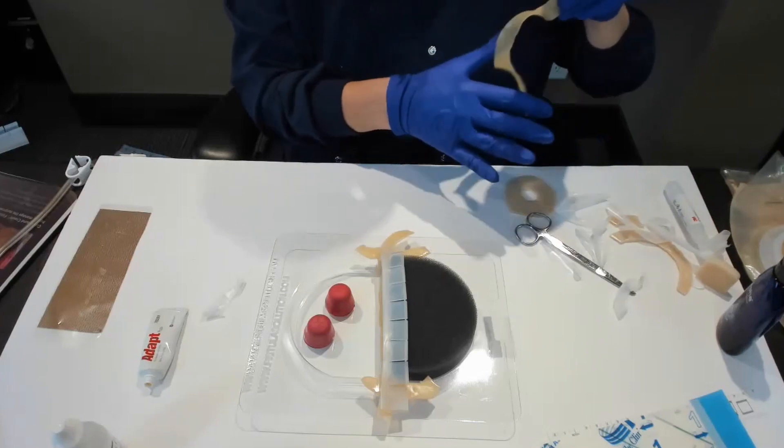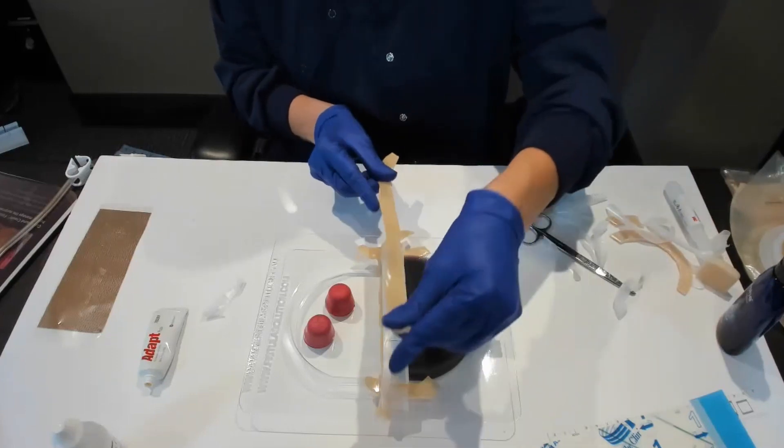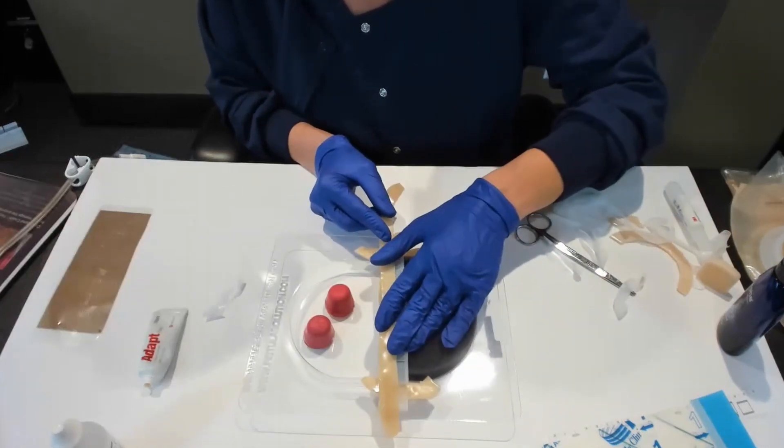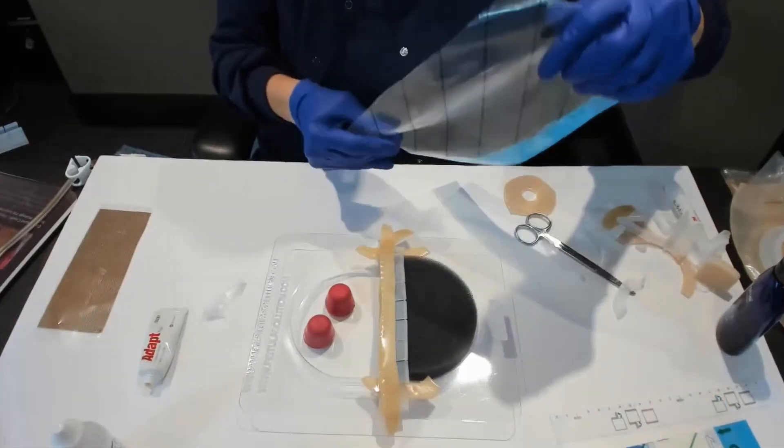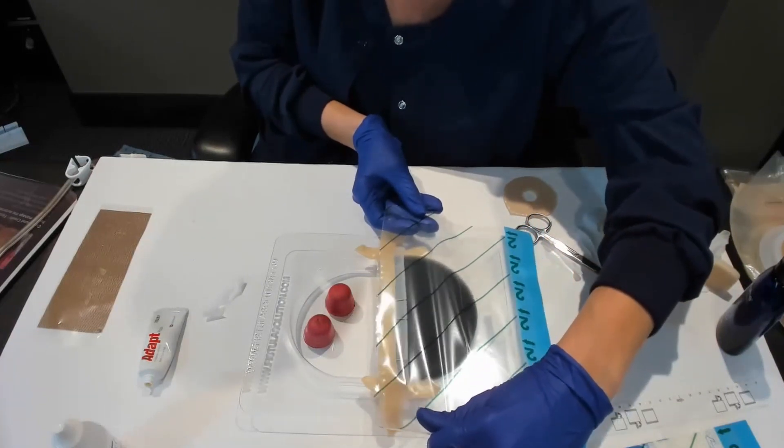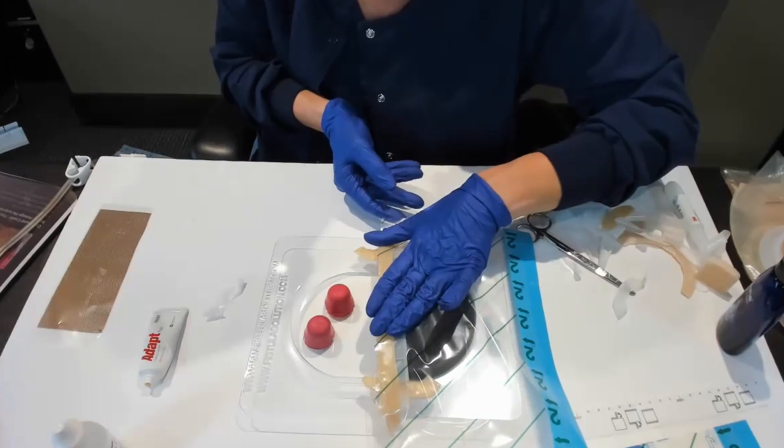This is some of the harder fistula cases. If you're using the strip, you got a lot going on. So I would like to go like this up and over the top.